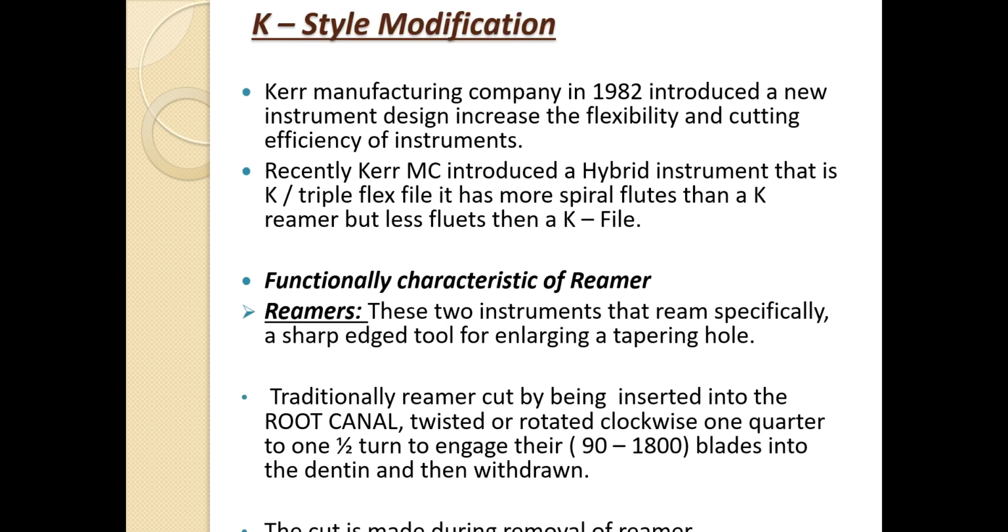K-style modification. Kerr Manufacturing Company in 1982 introduced a new instrument design to increase the flexibility and cutting efficiency of the instrument. Recently, Kerr introduced a hybrid instrument, that is the K-flex or triple flex file. It has more spiral flutes than a K reamer but fewer flutes than a K file. Functionally characteristic of reamers, these 2 instruments ream, specifically a sharp-edged tool for enlarging a tapering hole.